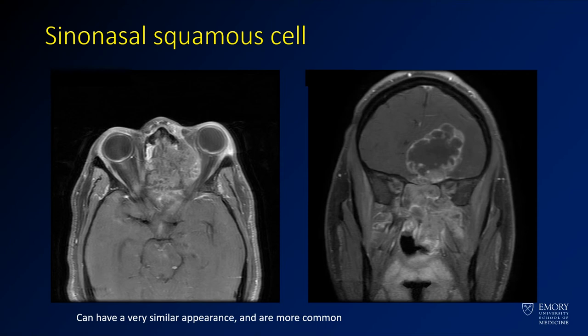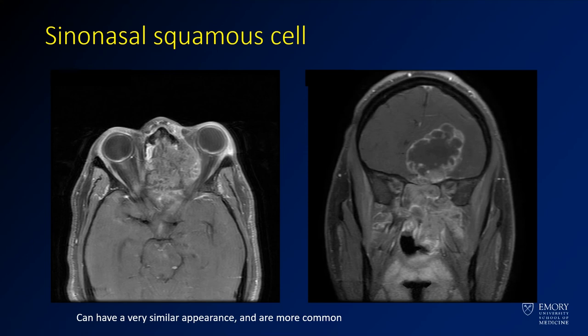This is an example of a sinonasal squamous cell carcinoma. The appearance is quite similar — you have a mass, but this one looks more aggressive, involving both sides of the nasal passages and the medial aspect of the left orbit. It involves the premaxillary space going into the orbit, with a very extensive intracranial component including intracranial cystic or necrotic portions. You should definitely want to rule out a sinonasal squamous cell carcinoma before definitively calling it an esthesioneuroblastoma. Luckily, these are quite easy to sample, as there is very accessible tissue available in the nose.